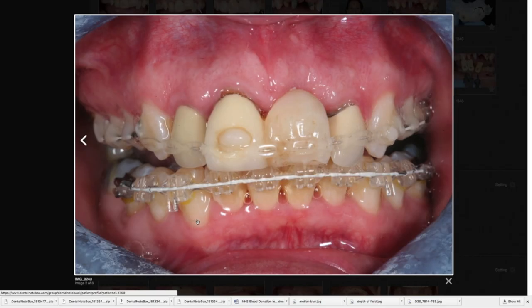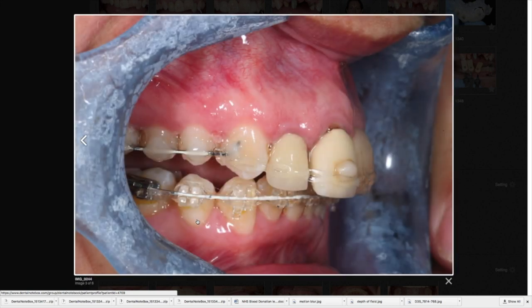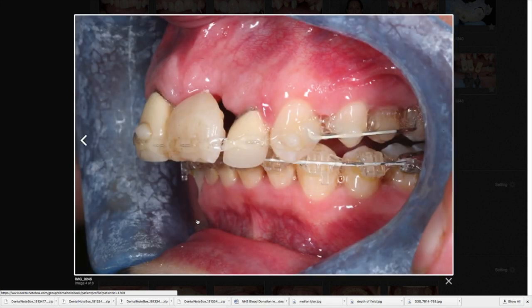After a few months, we actually got a pretty good result. You can see the power chain is still on the front teeth and they're pretty upright, which is good - that's what I wanted. About the temporary tooth: when we took out that stumpy root, we let it heal and I left her with a removable temporary denture. But when we want to retract the teeth, the power chain is going to push the denture out, the denture tooth isn't going to move, and everything's going to look misaligned. So what you do is make a composite tooth and bond it to the tooth next door. We've got porcelain both sides, so roughen the surface, silane, etch bond. That temporary tooth will then move with the power chain - which is pretty cool, exactly what we want. The bottom teeth are pretty much done - we just clean them up and put a retainer on.